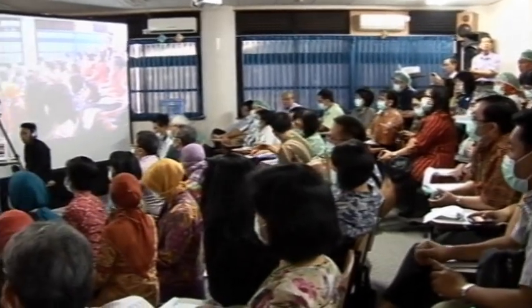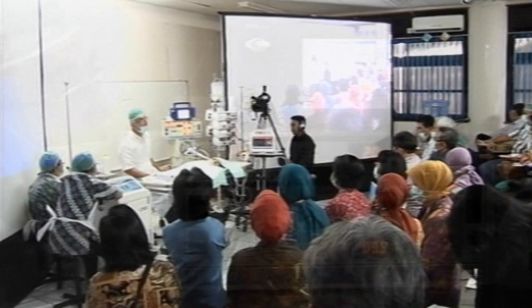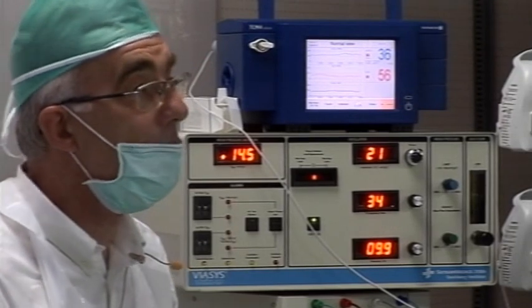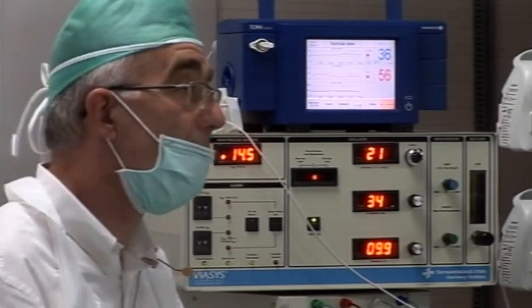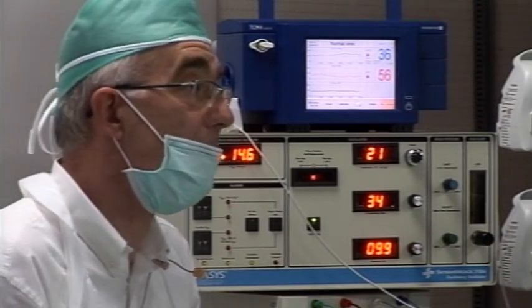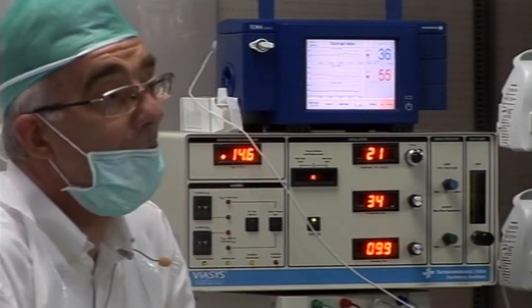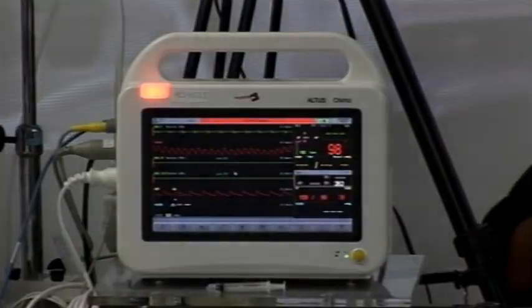Proactively, every 2 or 3 hours, as long as the baby stays at 21% oxygen or below 25, you decrease your CDP by 1 centimeter of water. And you wait 2-3 hours, and afterwards you decrease again. If the baby is in 21, that is because it's ready to be weaned down. So you further wean down. So how fast, I cannot tell you. You really have to be proactive.